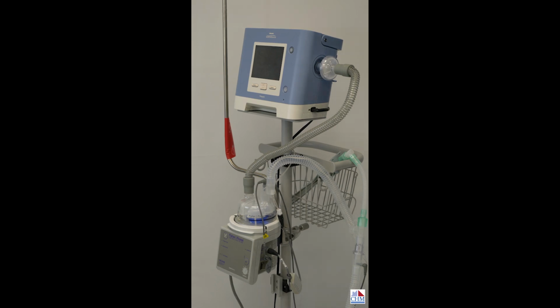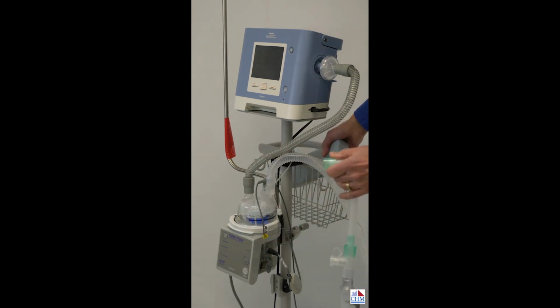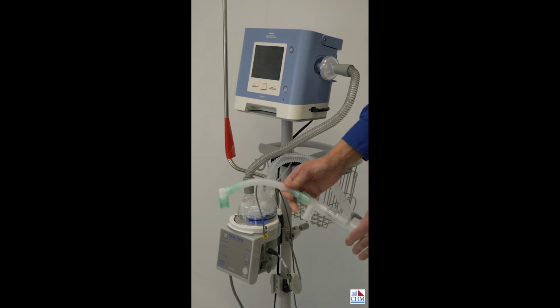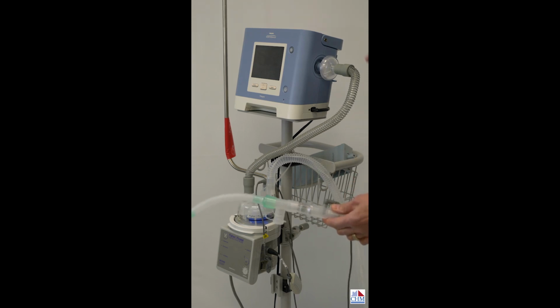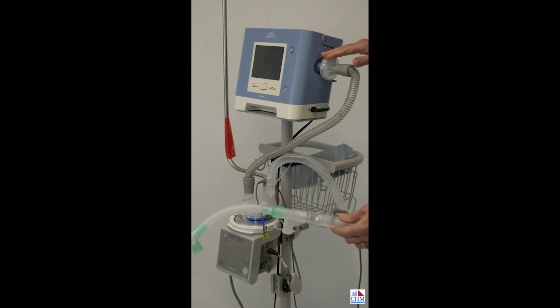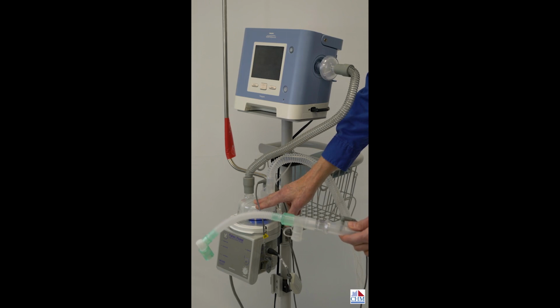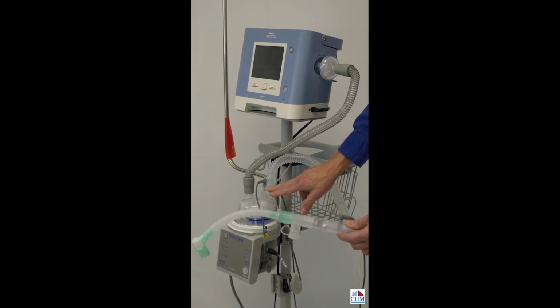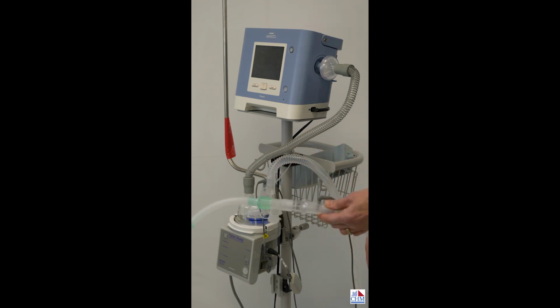We're looking at the tube circuit here for the Trilogy 100 ventilator. The circuit we're going to look at today is the passive circuit. What makes a circuit a passive circuit is the fact that it has a leak in it. So before we go through all the components, what we've got here is airflow that goes through a bacteria filter, goes through a short tube, down to the humidifying chamber, and then it's connected to a heated wire tubing that is about 6 feet long.